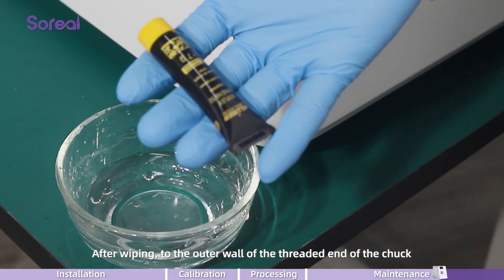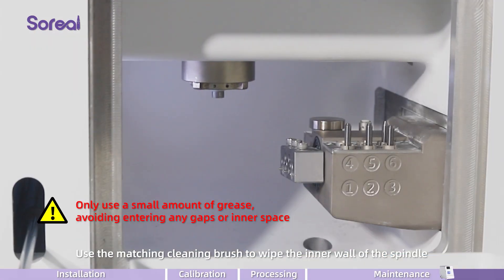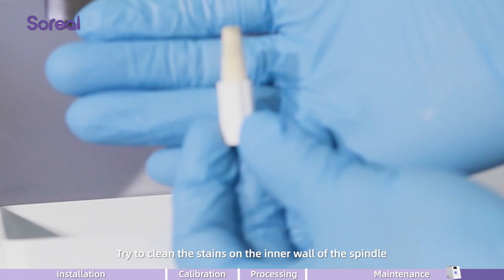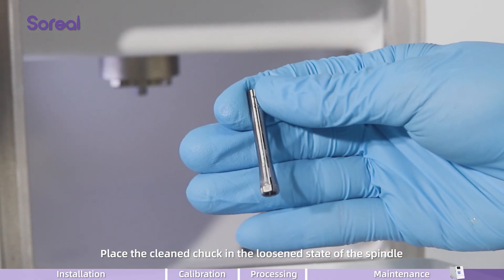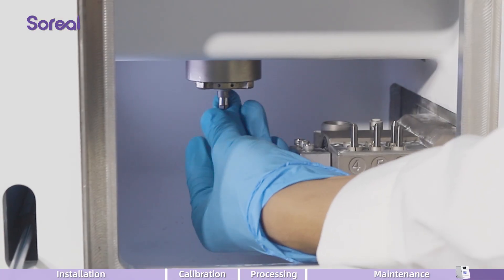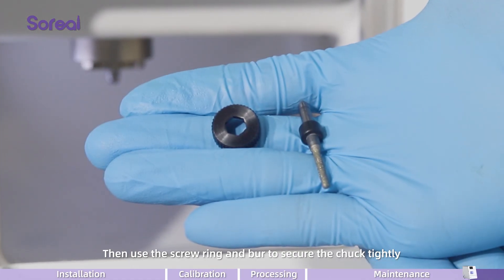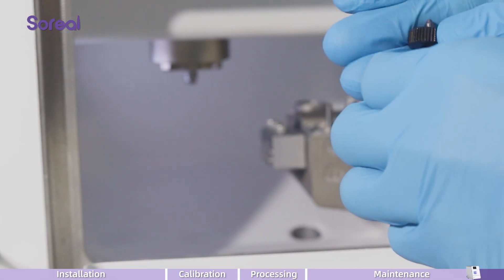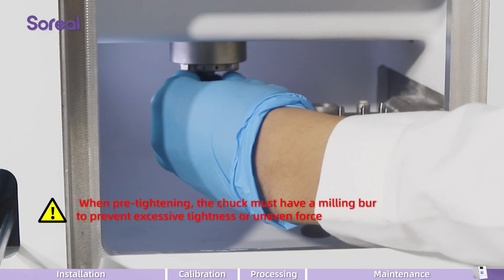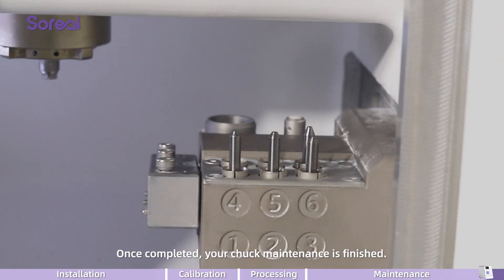After wiping, apply a small amount of compatible lubricating grease to the outer wall of the threaded end of the chuck. Use the matching cleaning brush to wipe the inner wall of the spindle and try to clean any stains on the inner wall. Place the clean chuck in the loosened state of the spindle and gently tighten it clockwise. Then use the screw ring and burr to secure the chuck tightly. When pre-tightening, the chuck must have a milling burr to prevent excessive tightness or uneven force. Once completed, your chuck maintenance is finished.